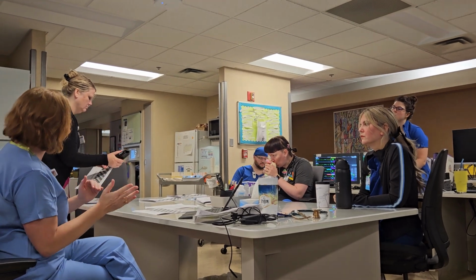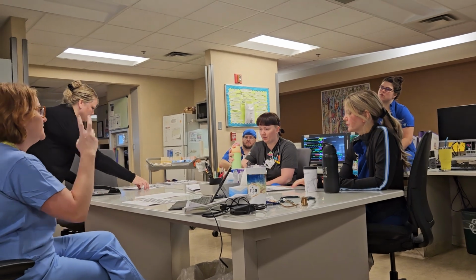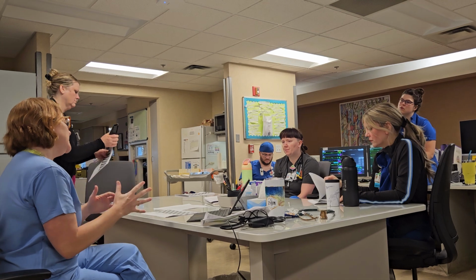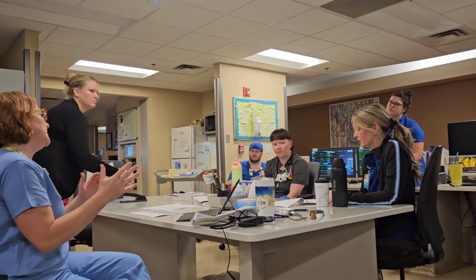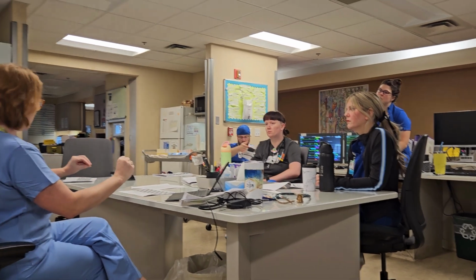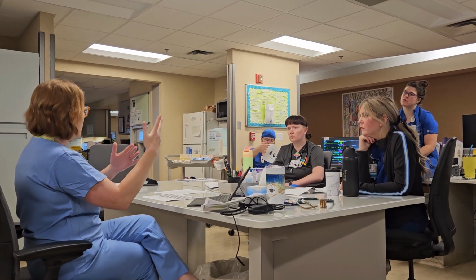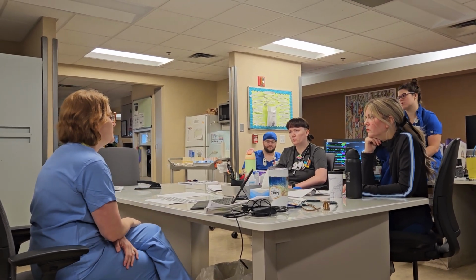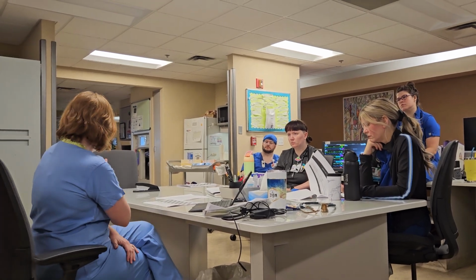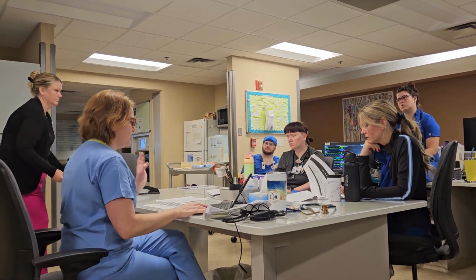What that can do for some patients, if they're over-breathing the ventilator or desynchronous with the ventilator, is that CMV, assist control, volume control, inherently can result in a respiratory alkalosis because we are forcing the patient to take 12 breaths a minute, and if they're not totally sedated, they might take an extra 8. And that's fine, but we have to ensure that they're not giving themselves a respiratory alkalosis, which is different from other vent settings, such as SIMV, which won't give the patient that targeted tidal volume if they should initiate it.